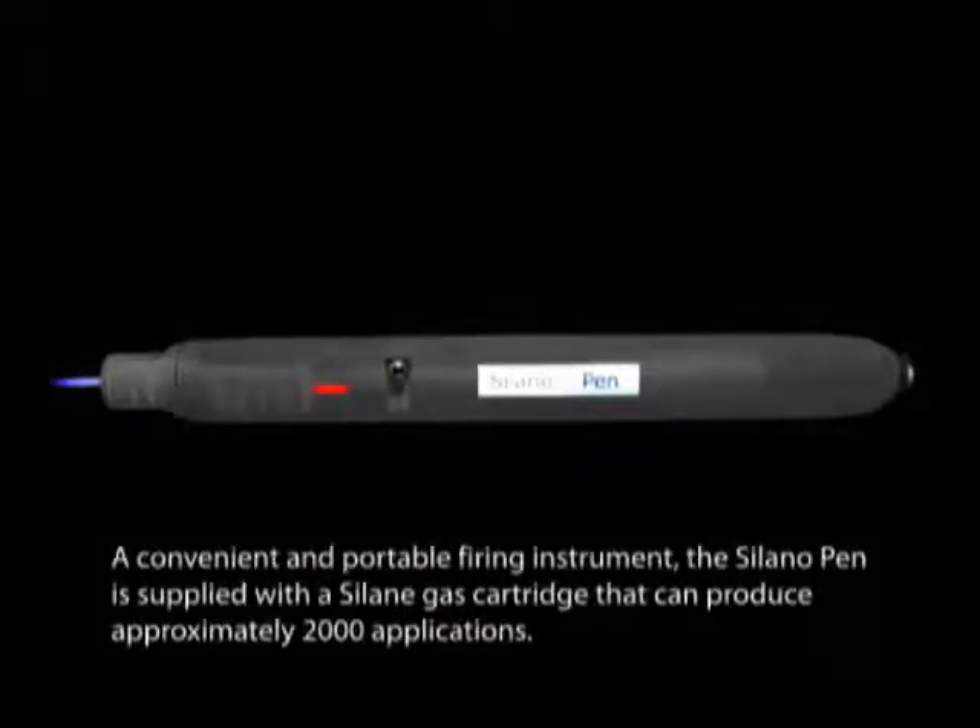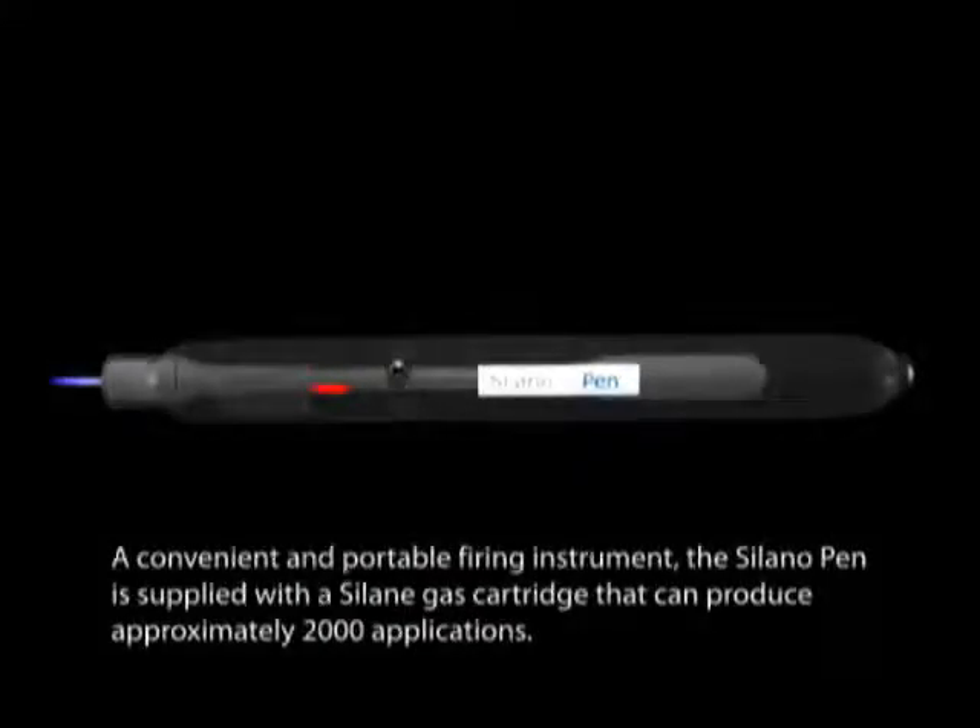A convenient and portable firing instrument, the Silano Pen is supplied with a Silane gas cartridge that can produce approximately 2,000 applications.